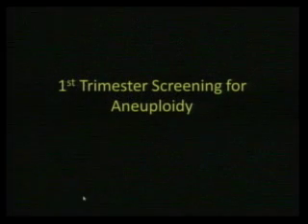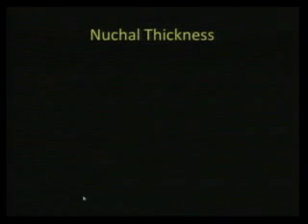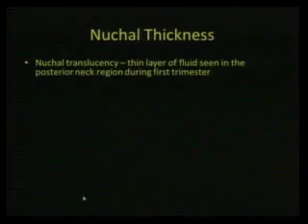All right, so a little bit about first trimester screening for aneuploidy. There's something called nuchal thickness that we look at. This is where we as radiologists have to choose our battles wisely. This is one of those things I would probably leave to the OBs, because you don't want to screw this up. They're doing this in most places, but I want you to be aware of it in case you see something like that and know what they're talking about. You don't want to mess up these measurements.